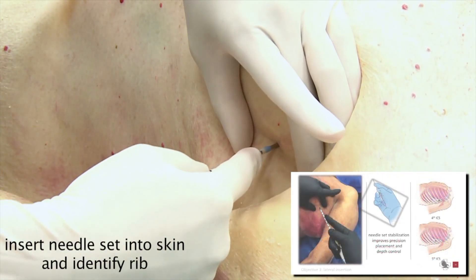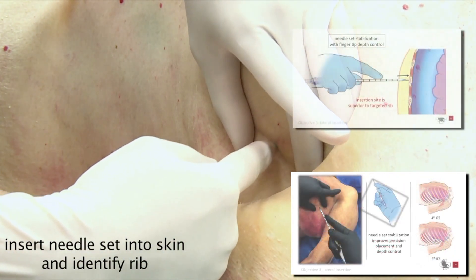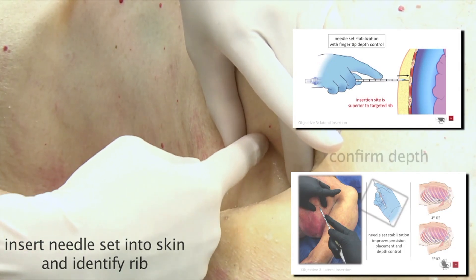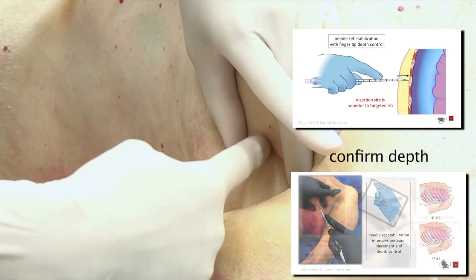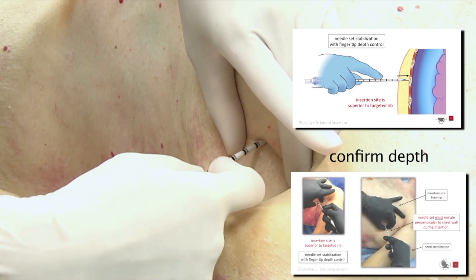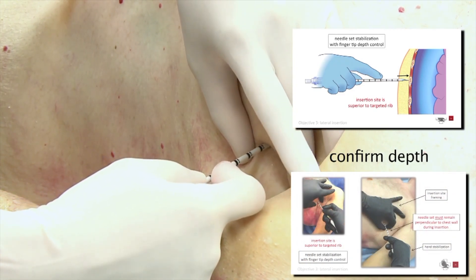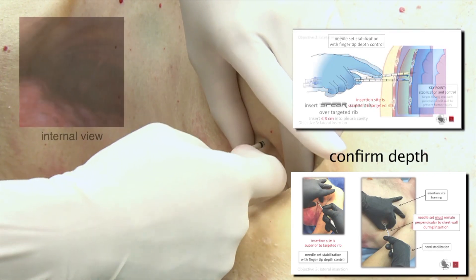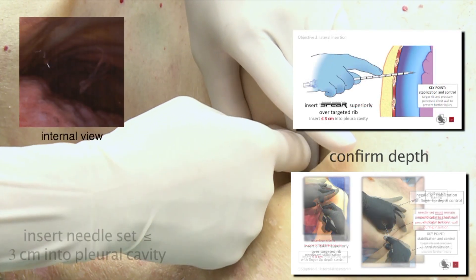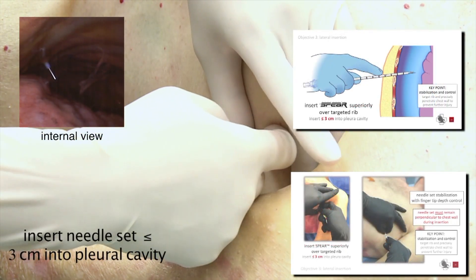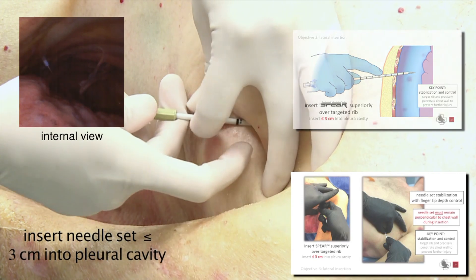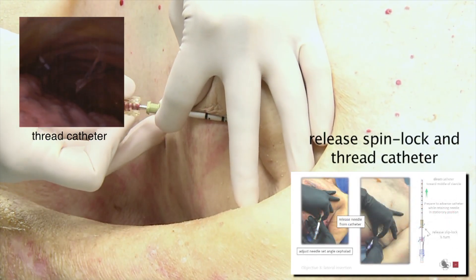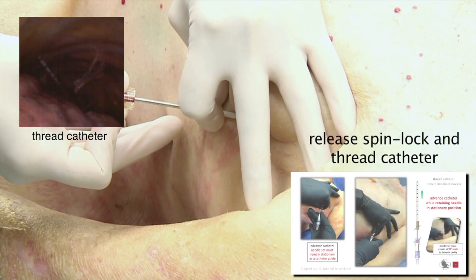Insert needle set into skin and identify rib. Confirm depth. Insert needle set less than or equal to three centimeters into pleural cavity. Release spin lock and thread catheter over the rib.